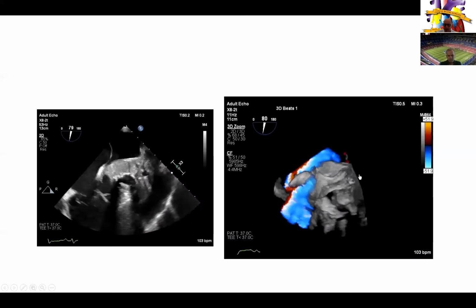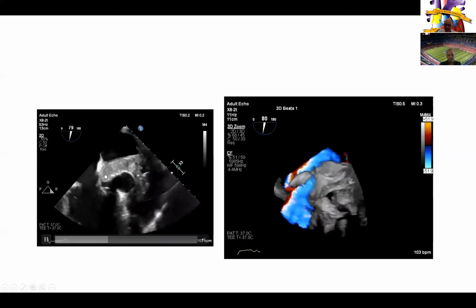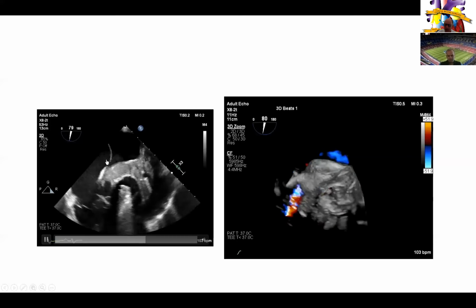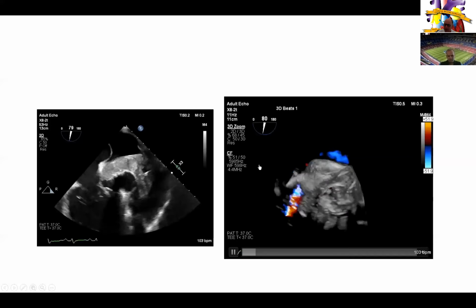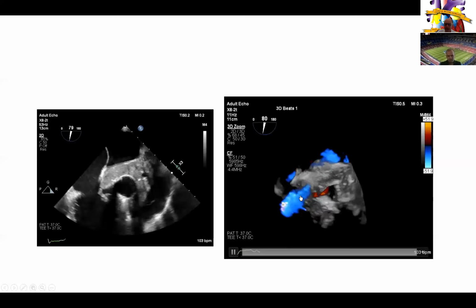And you can see almost the base of the heart falling apart here, right? You know, everything is infected, right? At the crux of the heart, between the tricuspid valve, the mitral valve, the aortic valve, and the intra-atrial septum up on top. And here by 3D color, you can see the flow entering the right atrium.